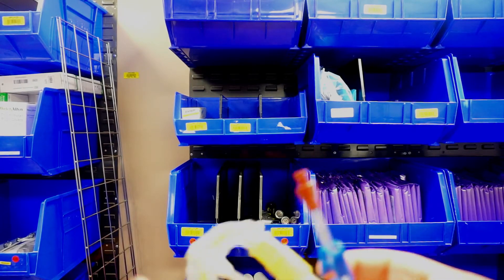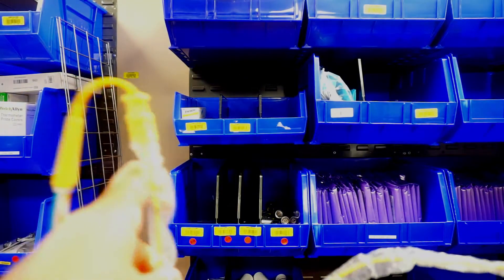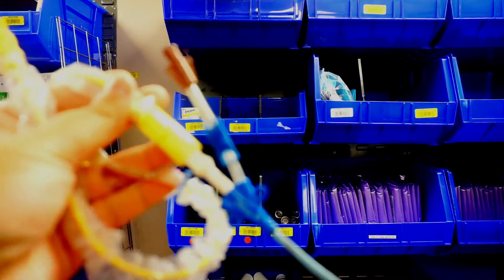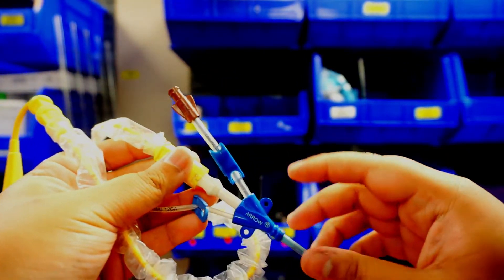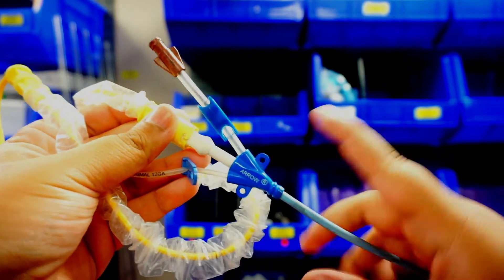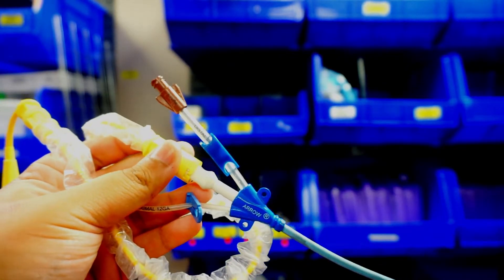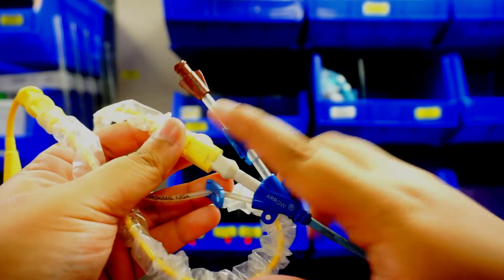So as a refresher, you have your Swan line that's going to be connected to your Cordis here and your white port here. It's going to be sutured in place, hopefully your line is sutured in place, and we want to take the Swan out.